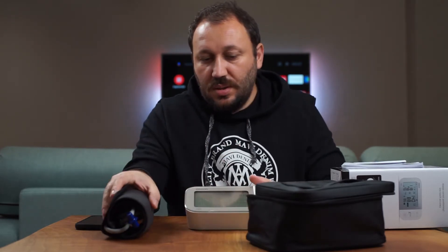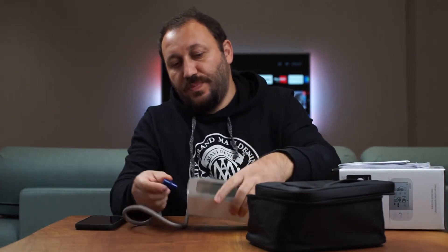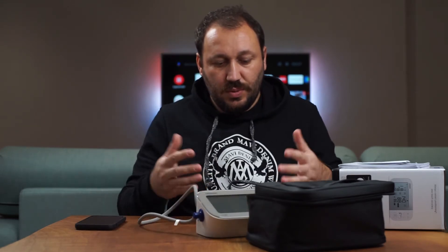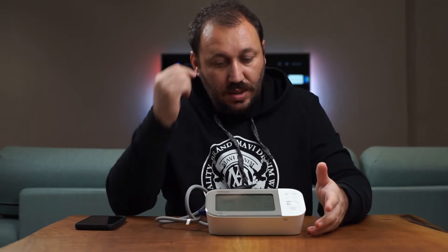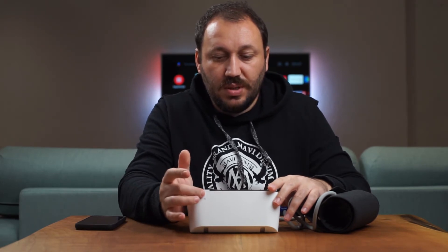Omron is quite stable on battery — it doesn't drain quickly. When you put the batteries in, it prompts you to set the date and time. You press the air strap here and the air goes in to do the measurement. Before measuring, let me clear this up and show you how the measurement works.